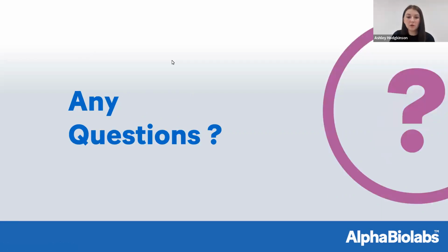Yeah, definitely. They're still coming through, so carry on sending them. We'll answer as many as we can, obviously sticking to time. So there's 2 people that have asked a similar question about, do the same measurements apply to different textures of hair? So would tightly coiled hair be measured in its natural state or straightened out? And we had this question yesterday about any afro hair that we've collected. So the answer is it totally depends on the hair that we take at the time. So it's difficult to generalize because sometimes they are really tightly coiled and they can't be straightened, and sometimes they can be straightened out. So it does depend.